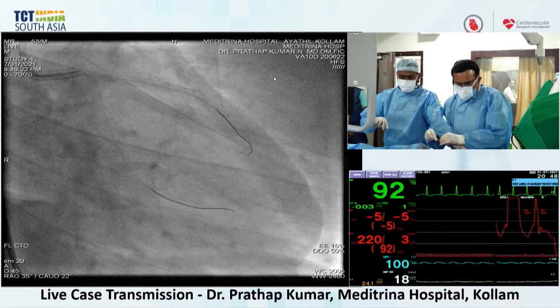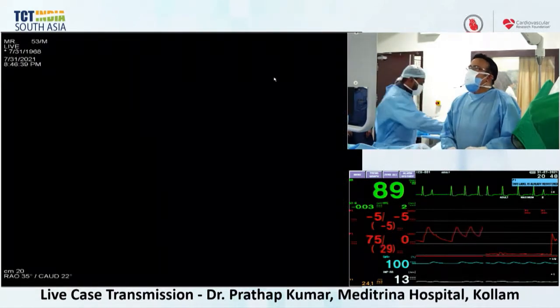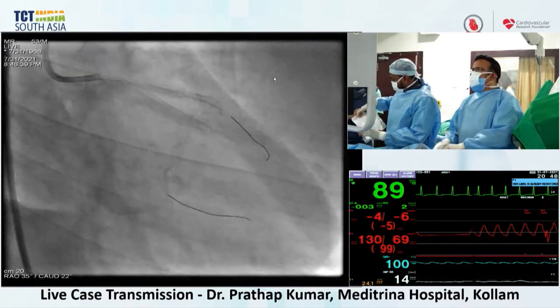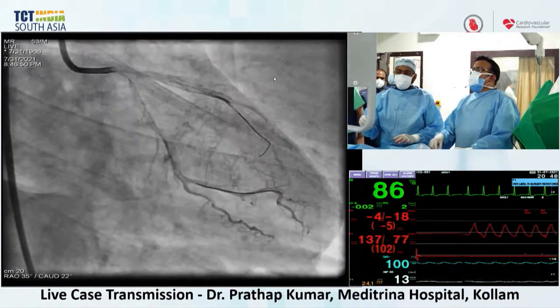Yeah, but if you put a small balloon at low pressure, 4 atmospheres, and you occlude the distal flow at the main collateral, you're not going to injure the vessel. I don't disagree with you. I think the point is that we can always use collateral flow to identify whether or not our distal vessel is good, and that works in either direction.